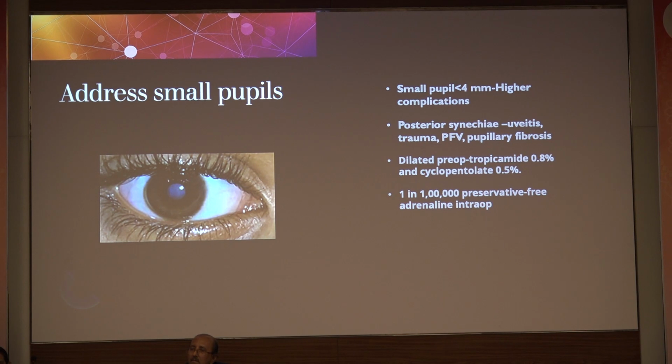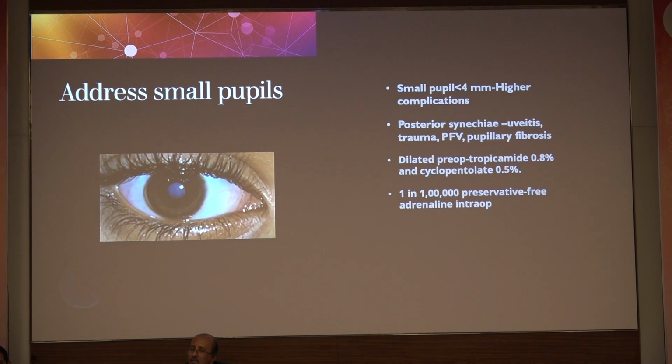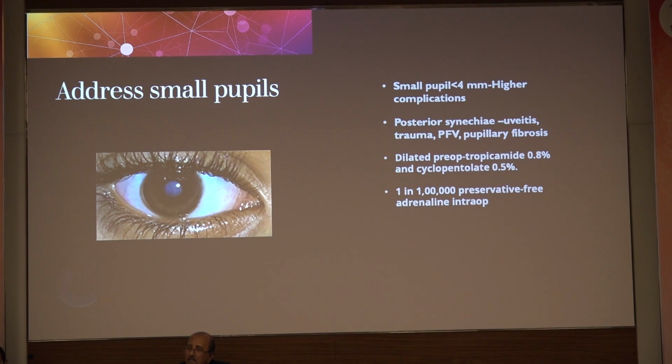To address smaller pupils in children: small pupils less than 4 mm in diameter lead to a higher rate of complications.